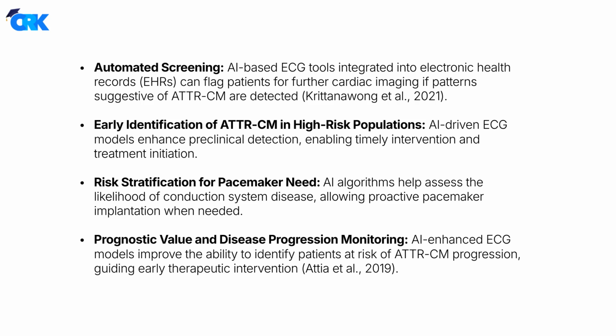Additionally, AI-driven ECG models can help stratify patients by their likelihood of needing a pacemaker. Given that conduction system disease is common in ATTR-CM, this tool can be instrumental in determining which patients may require early device implantation. Finally, the prognostic value of AI is significant. It allows clinicians to monitor disease progression and to intervene with disease-modifying therapies at the optimal time.